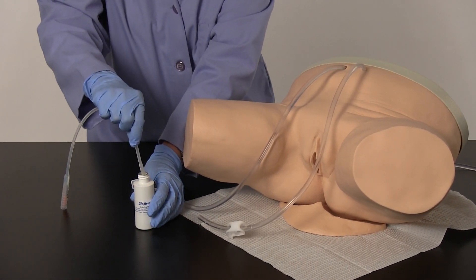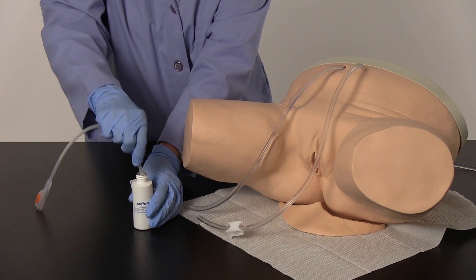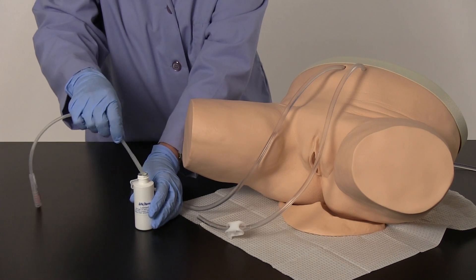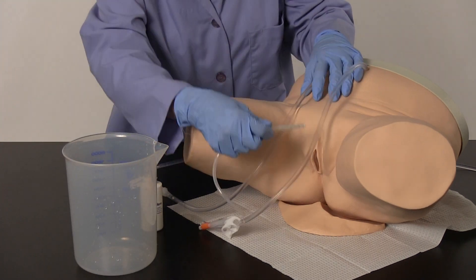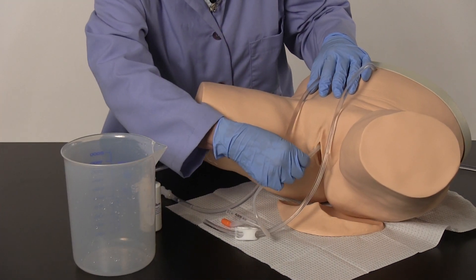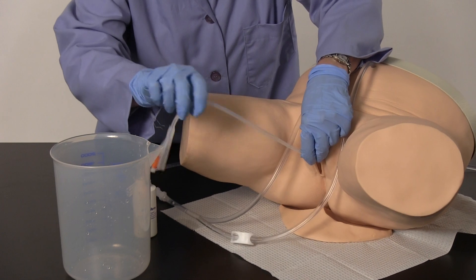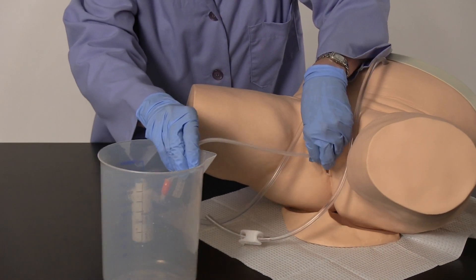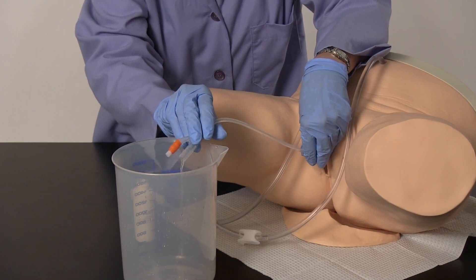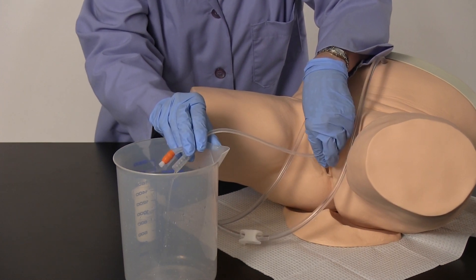Generously lubricate the supplied 16 French silicone Foley catheter. Slowly insert the lubricated catheter into the urethra and through the simulated sphincter. With experience, you will feel a pop as the catheter passes into the simulated bladder. Continue inserting until the water flows from the catheter.